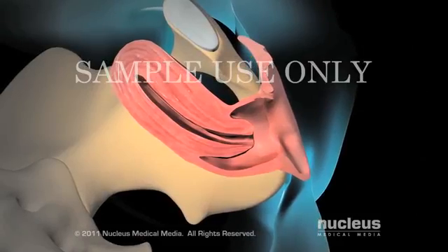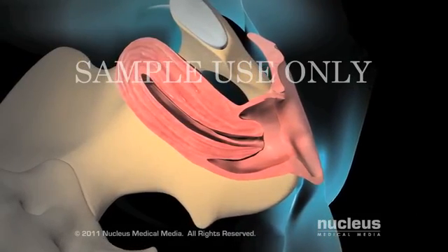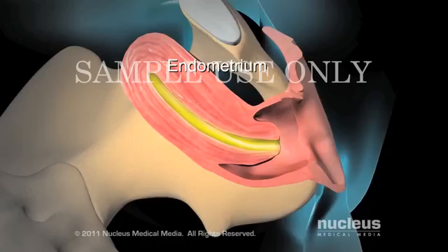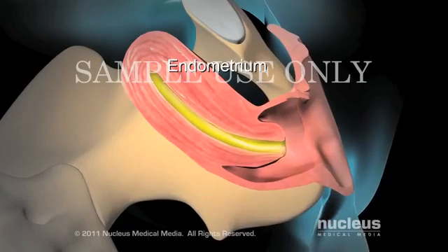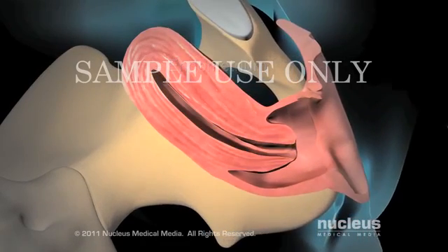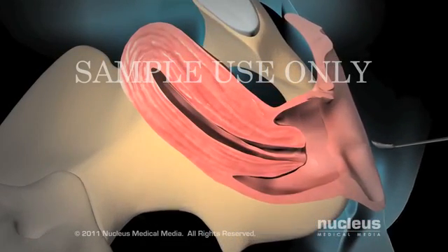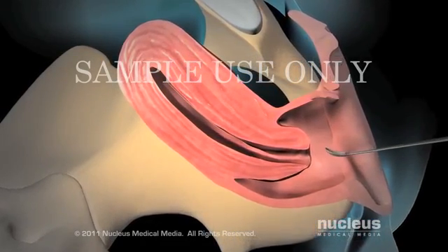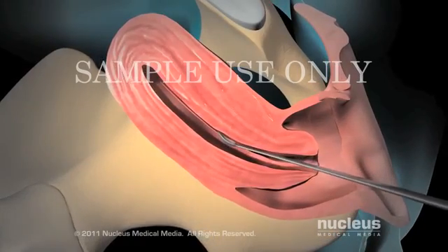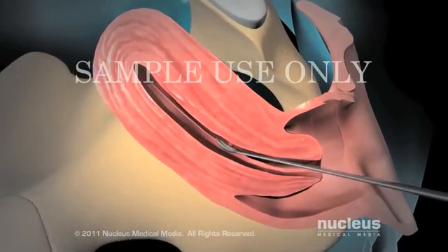Next, your doctor will perform curettage, which is the surgical removal of part or all of the uterine lining, called the endometrium. During curettage, a surgical tool called a curette will be inserted to remove tissue by scraping or suction.